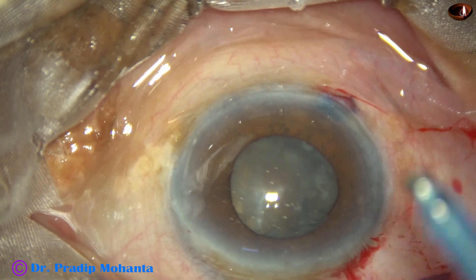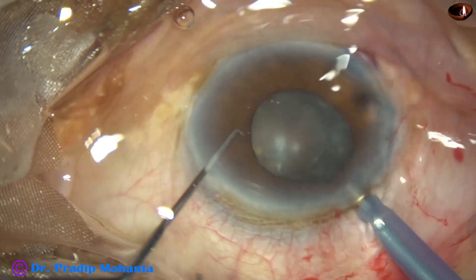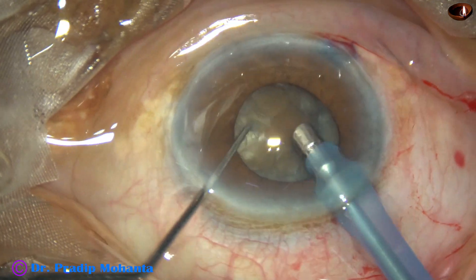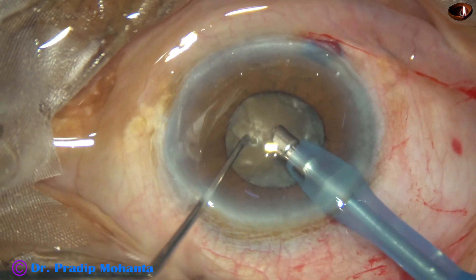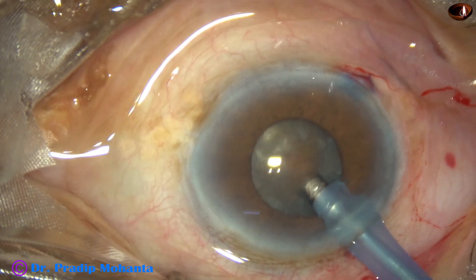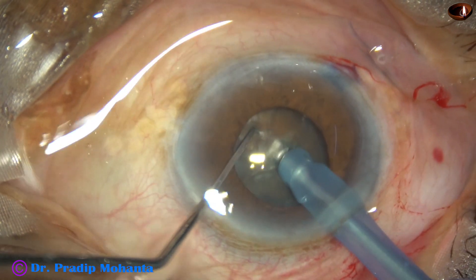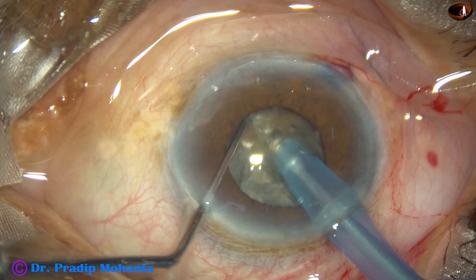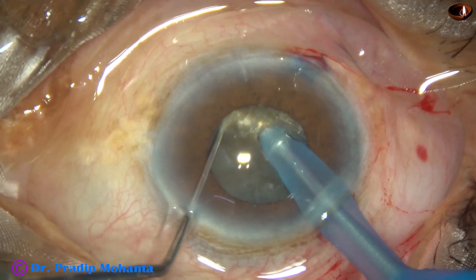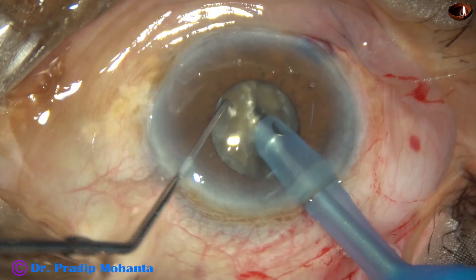Hydrodissection has been done and now is the time to manage the nucleus. The phaco needle goes in with its bevel down. Some superficial cortical lens matter is removed, and as I do this, the size of the pupil has become smaller — about 3 mm now. As I try to chop the nucleus, it is still about 3 mm but sometimes it will be smaller than this.